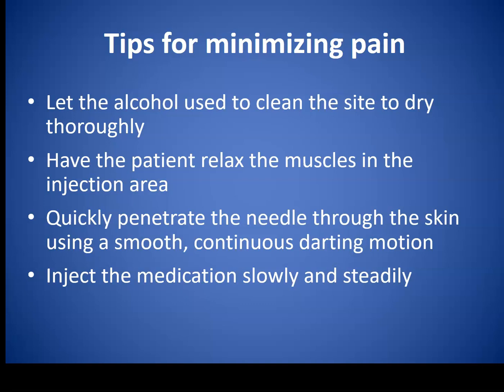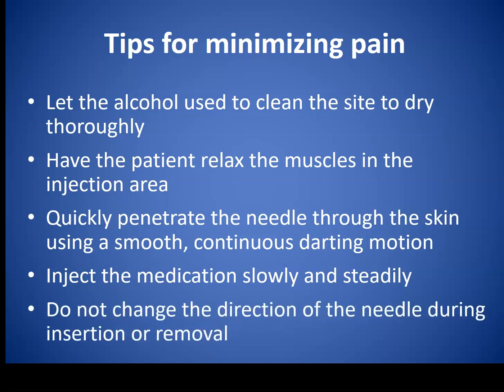And then you want to inject the medication slowly and steadily. Okay, don't start, stop, start, stop. Just slowly and steadily until it's all gone. And then when you're removing the needle after injecting, don't change direction. Okay, if you've gone straight in at a 90-degree angle, come straight out at the same angle. Because if you change direction, that hurts. Yikes.